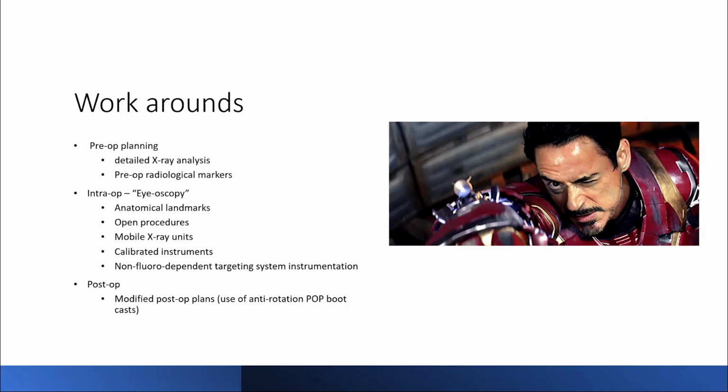So if you were doing a SCFE, for example, or if you are attempting to do a guided growth for an open physis, you place your K-wires, have the mobile X-ray brought in, you take your X-rays intraop and wait for the films to be developed. And then you see which of the wires is where you want it to be. The problem with that is it causes an unnecessary prolongation of surgery.